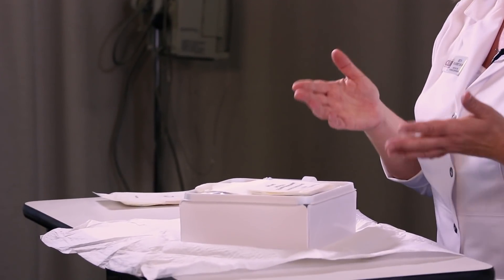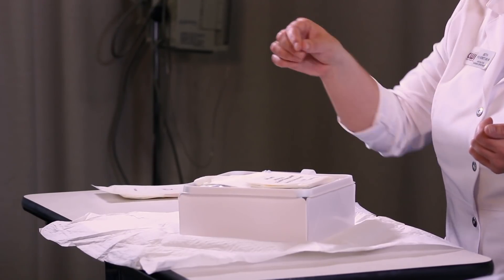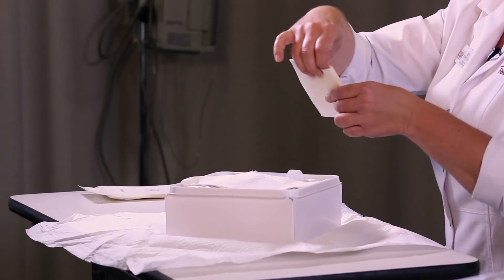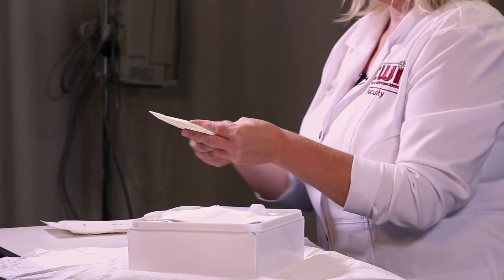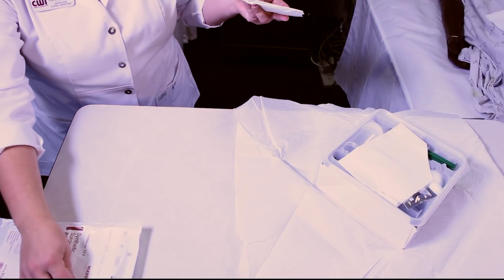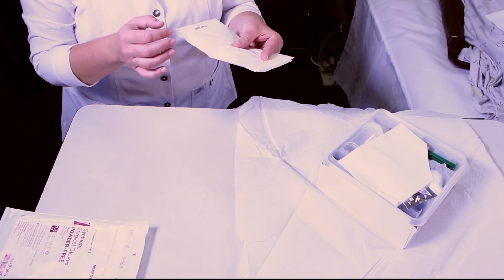Now you'll see your supplies. On the top, there will be a drape that will go on the bed between the legs of your patient. Next step is to get your sterile gloves — they are next on top. Be careful not to touch your sterile field. I also have an extra pair of sterile gloves, because inevitably if you don't take an extra, you will need an extra.